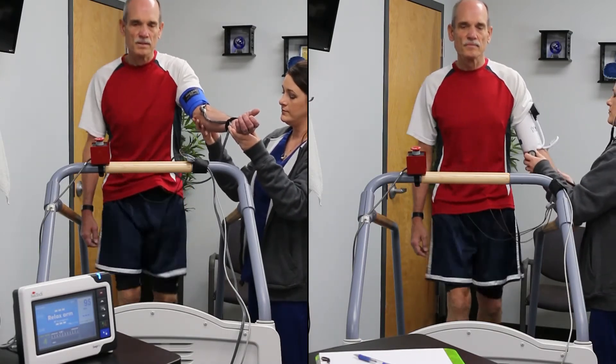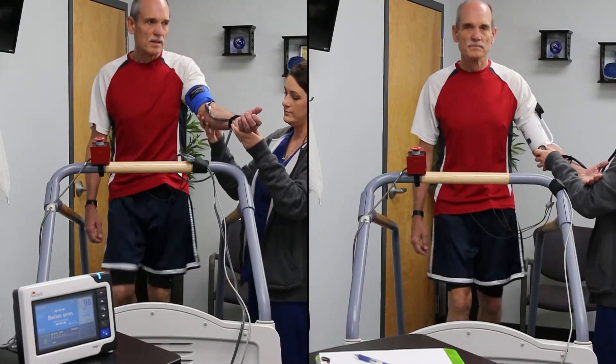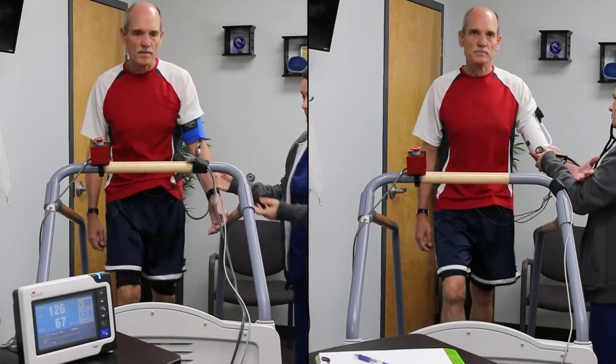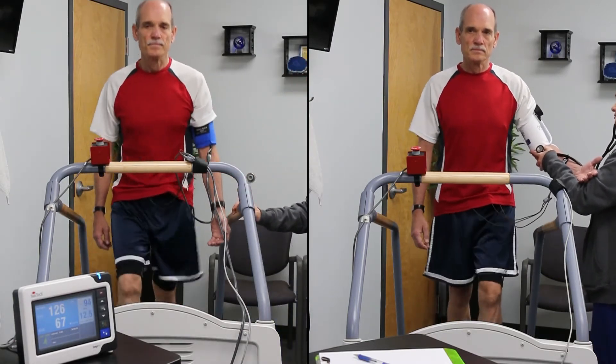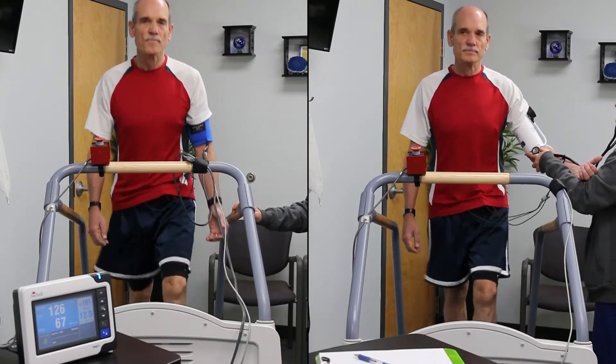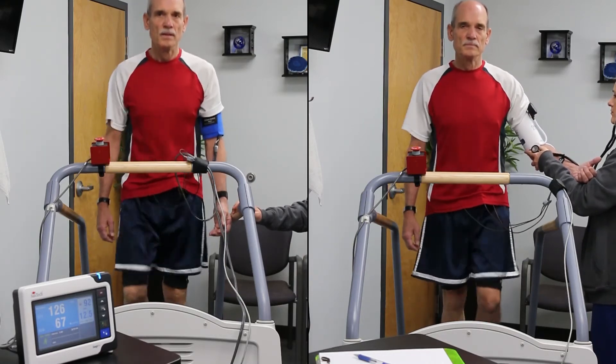To get accurate readings, both the Tango M2 and the clinician are deflating the cuff at 2-3 mmHg per second. Systolic blood pressure typically rises as exercise intensifies. Reliable blood pressure measurement during exercise stress testing is essential to making an accurate diagnosis.